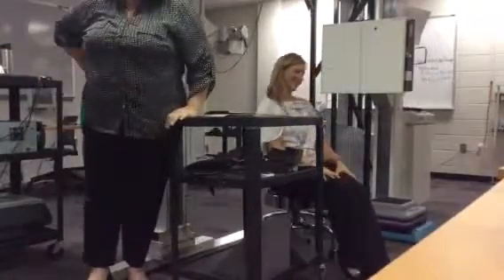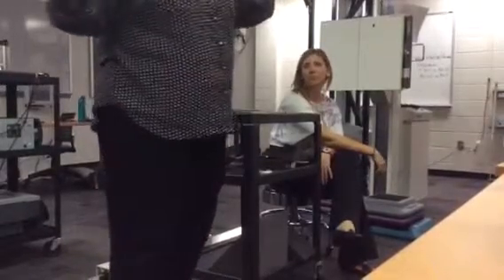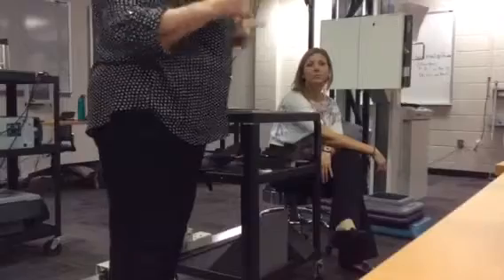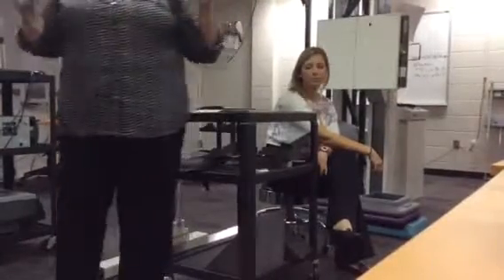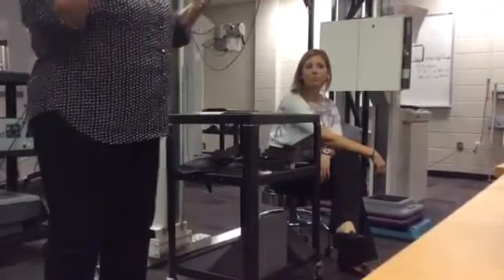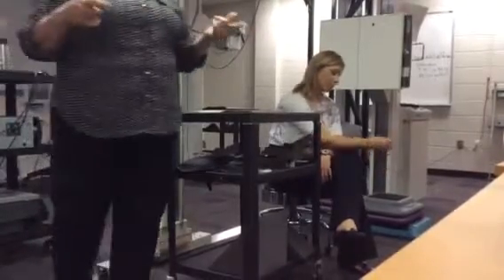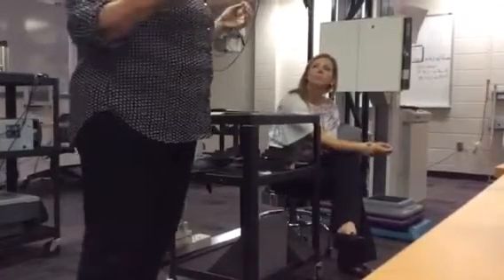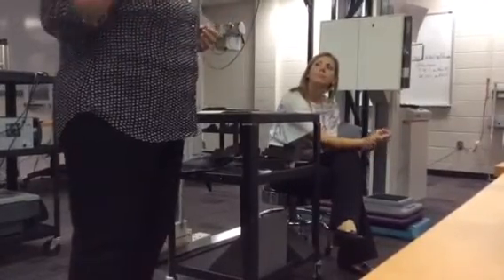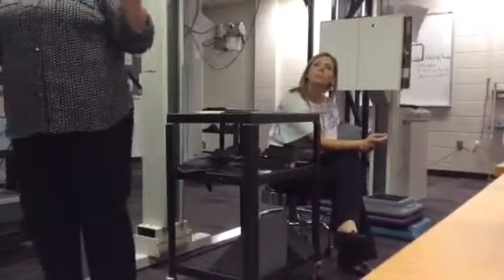The adult arm is longer than a 12-inch film. So that means that you can't see all of the humerus, all of the radius and ulna on one exposure. So it is standard practice to just demonstrate at least one joint and a long bone. Now, your emphasis is not on the joint, but you have to see the joint in order to see the extreme ends of the radius and ulna. And that's the whole purpose of it.